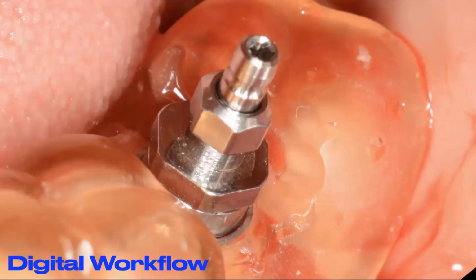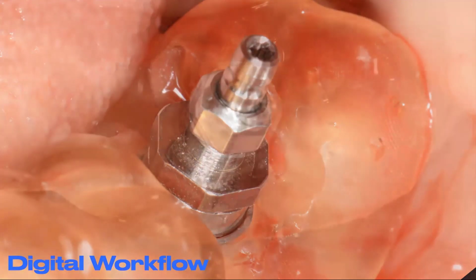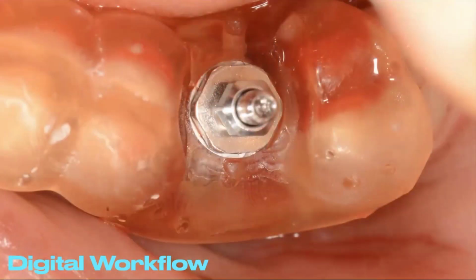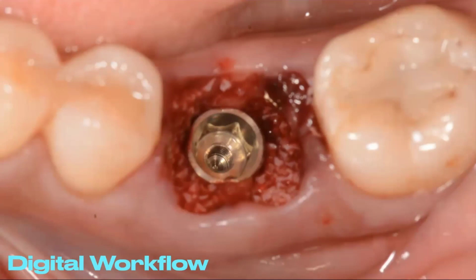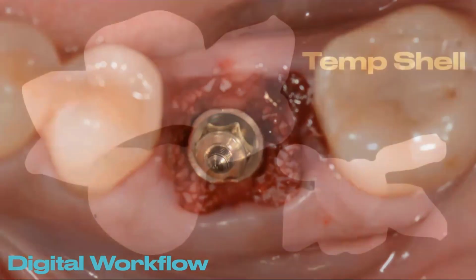We place our implant through the surgical guide with this tool that we utilize the cone beam CT technology to do. And then you can see here we've placed this implant exactly where we wanted it. From there, we can see our implant's placed at the proper depth. It's placed right where we want it to be. There's bone all around it. We're not to the buccal. We're not to the lingual.